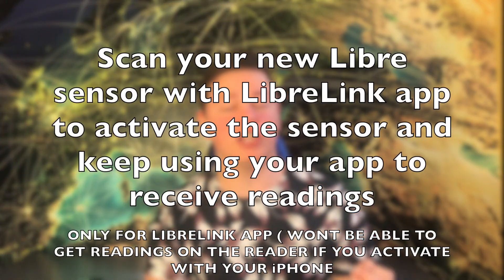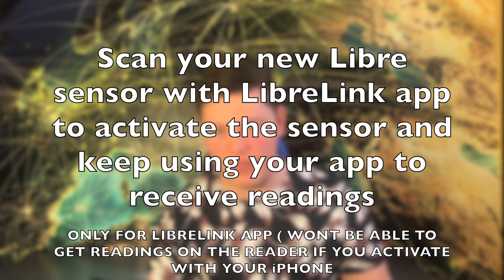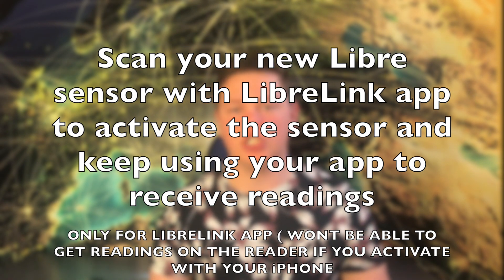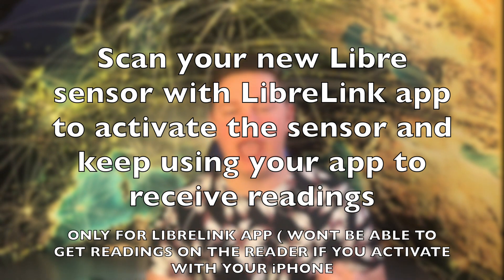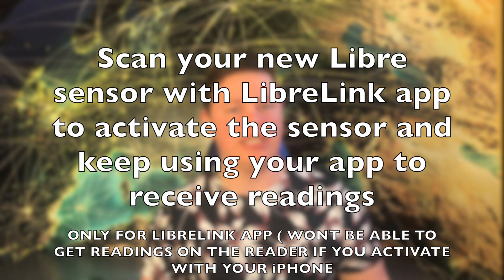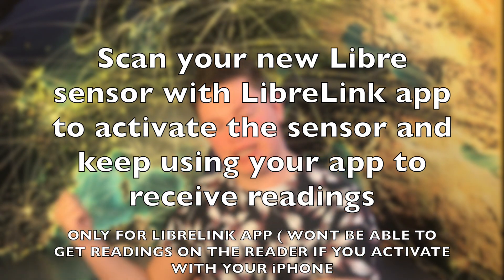The other option is if you don't have the Freestyle Libre Reader — you can use the Libre Link app on your iPhone to actually activate the sensor. If you've never used the Freestyle Libre system and you have an iPhone, this is a great opportunity to just buy one sensor, activate it with your iPhone, and use just your iPhone for the entire two weeks to see if you like it.